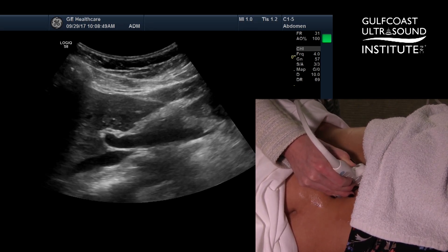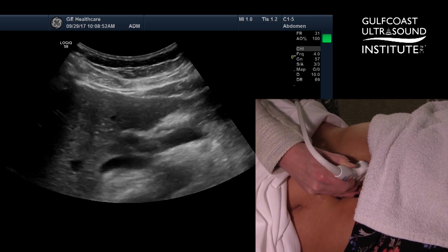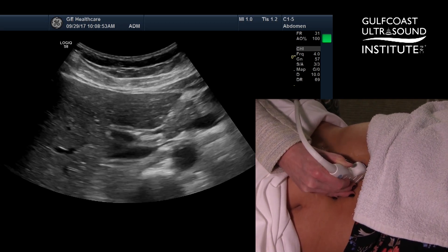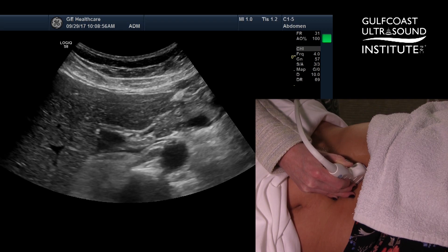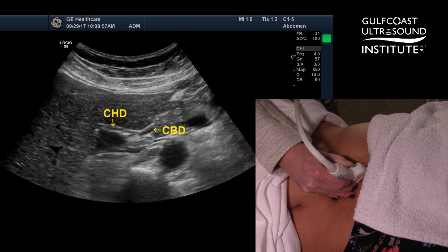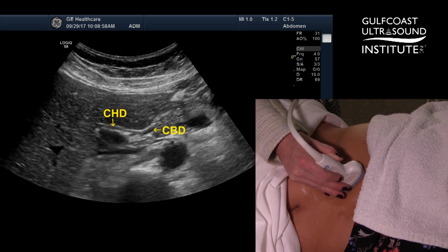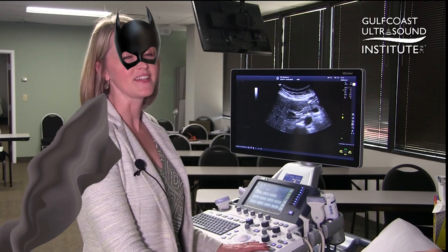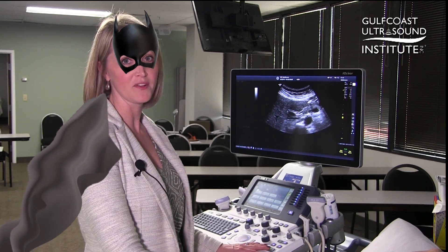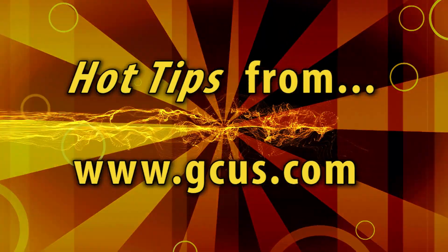Have your patient take a breath in and hold their breath. From there you can lengthen out the common bile duct and common hepatic duct using the Kazam view. That's your hot tip for the day. Now you try it.